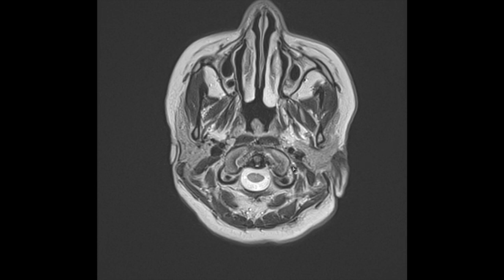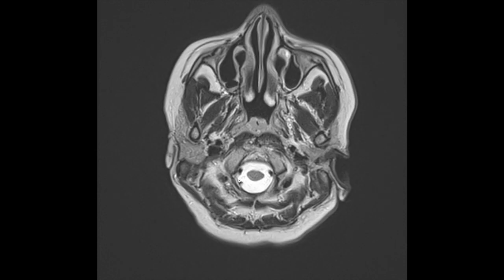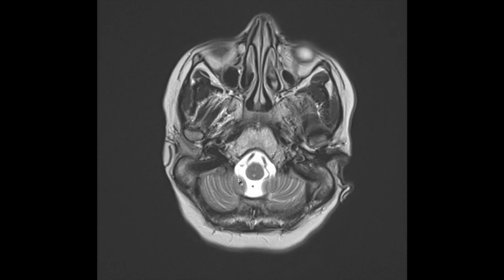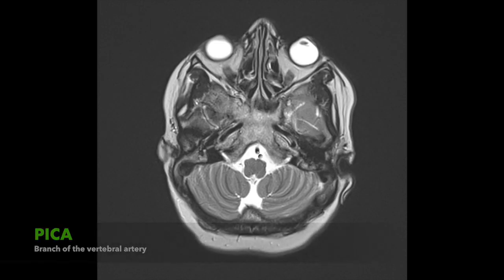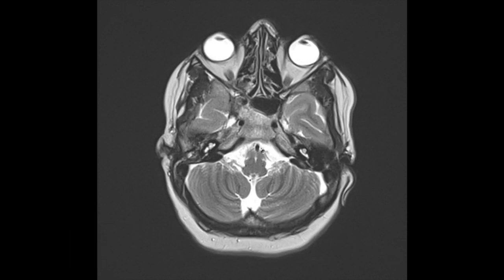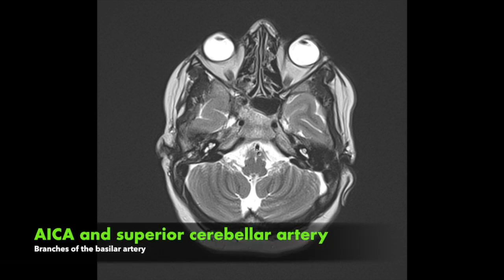Now we'll go through some arterial anatomy. What we see here are the vertebral arteries coming up, and just before they form the basilar artery you can see they give off the PICA — the posterior inferior cerebellar artery. They then form the basilar artery, and coming off the basilar artery is the AICA — the anterior inferior cerebellar artery. It's quite a thready artery so you don't always see it, and it's certainly less conspicuous than the PICA.